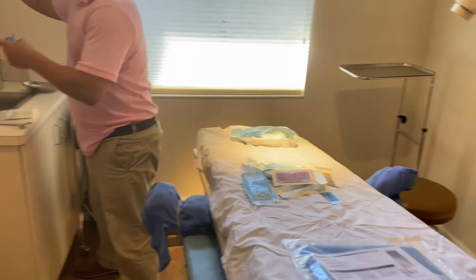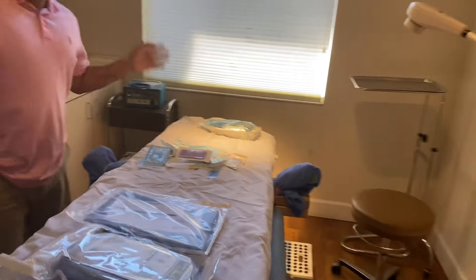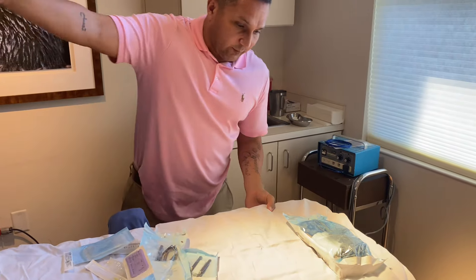The most important thing is to always make sure you have a sterile field, because if you contaminate something you have to start all over. And if you contaminate the instrument sets, you're going to have to start all over and delay the vasectomy reversal.